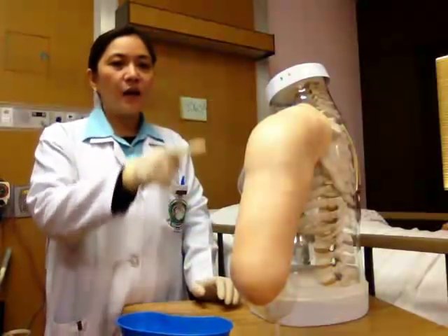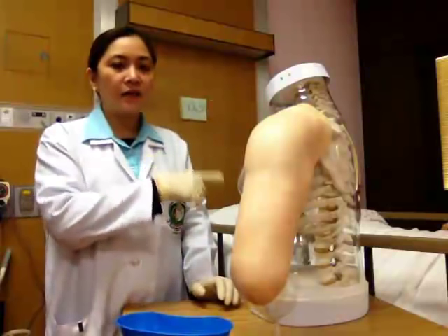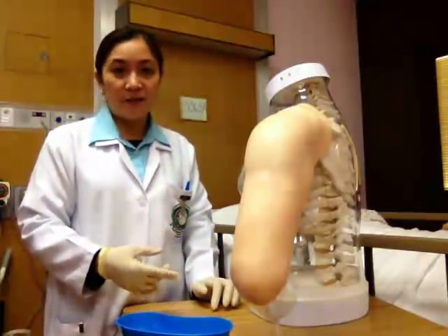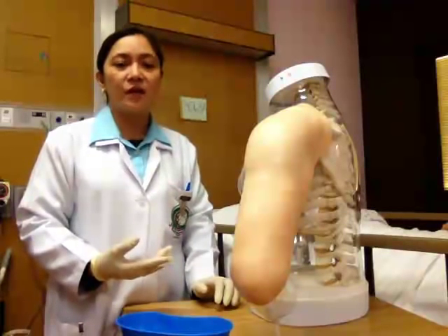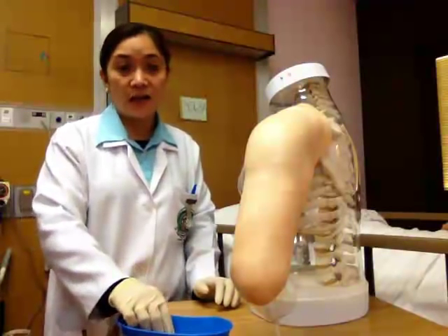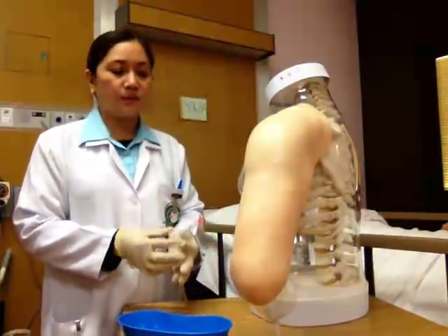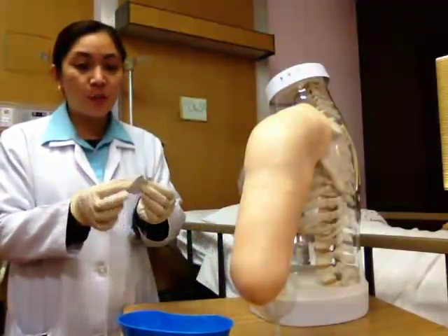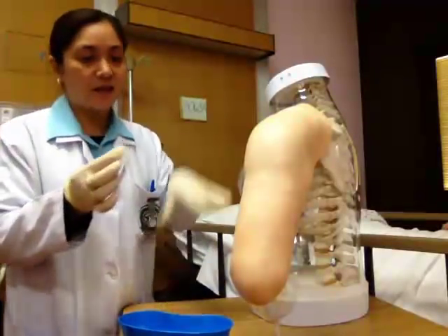So in a rotating manner, we can alternately give this injection to our patient if she is regularly receiving subcutaneous injections like insulin injections. The same thing, we have to cleanse or prep the injection site.